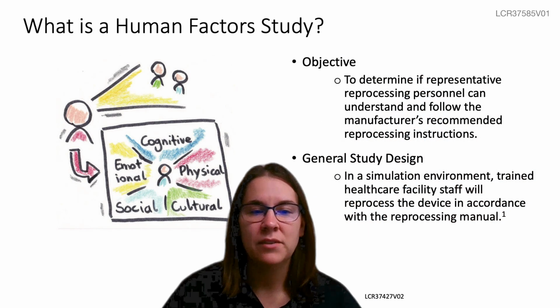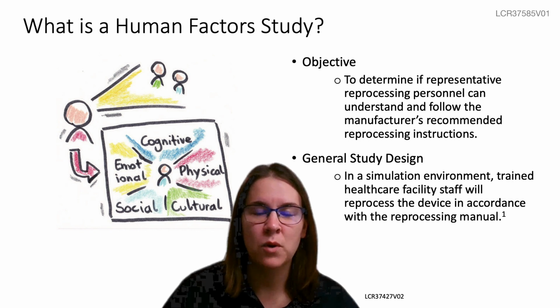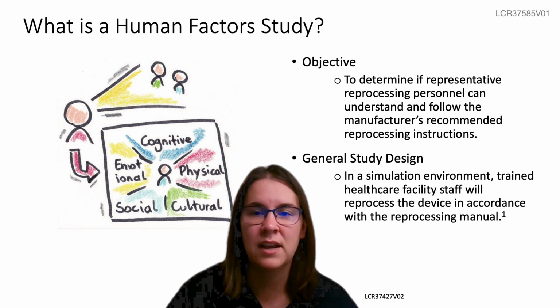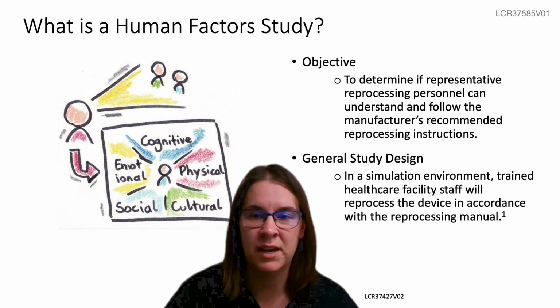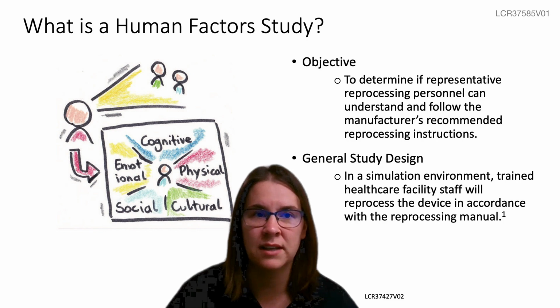First, I'd like to give you a high-level overview of what a human factors study is. The main objective when performing a human factors study is to determine if reprocessing personnel can understand and follow the manufacturer's recommended reprocessing instructions as written in our IFUs or instructions for use. The general study design includes a simulation environment where trained healthcare facility staff will reprocess the device in accordance with the reprocessing manual. These trained healthcare facility staff are the reprocessing technicians and nurses who would normally be doing this job on a daily basis.